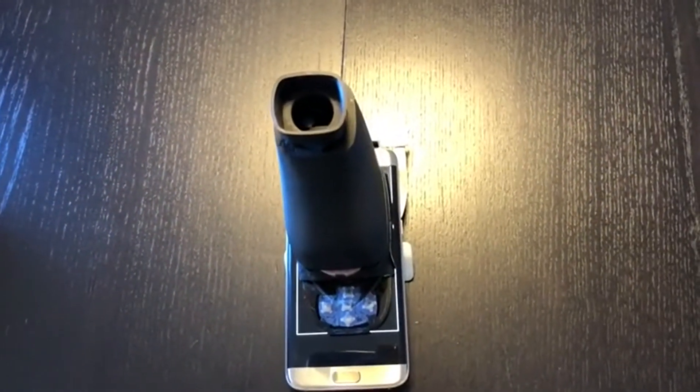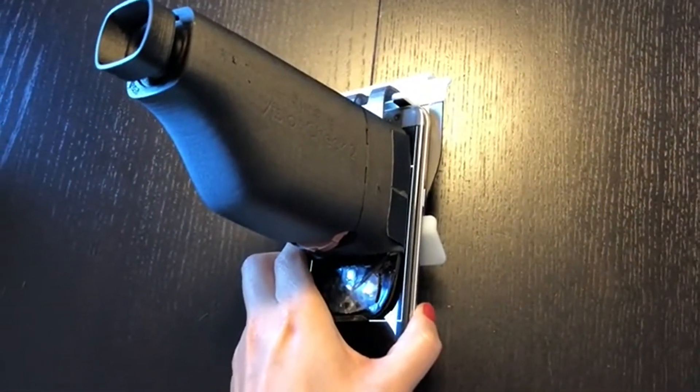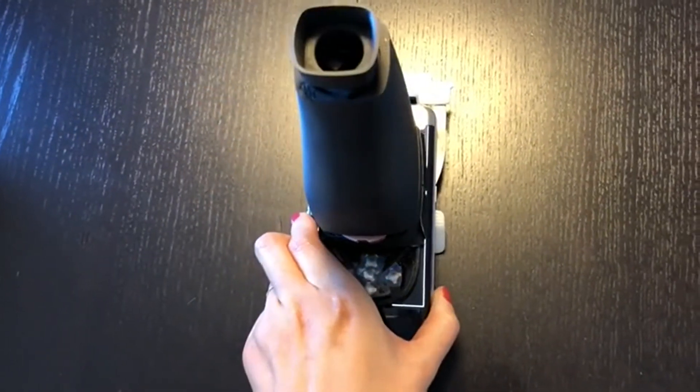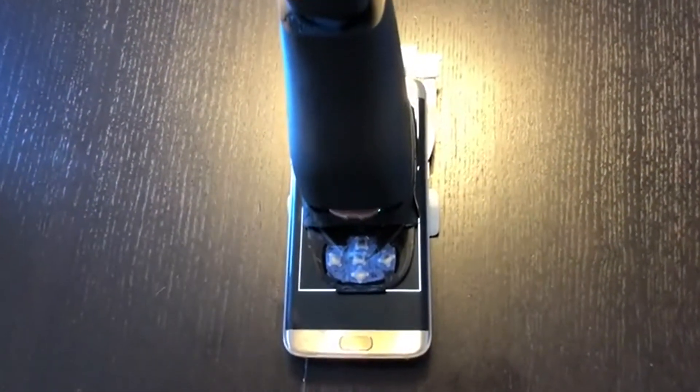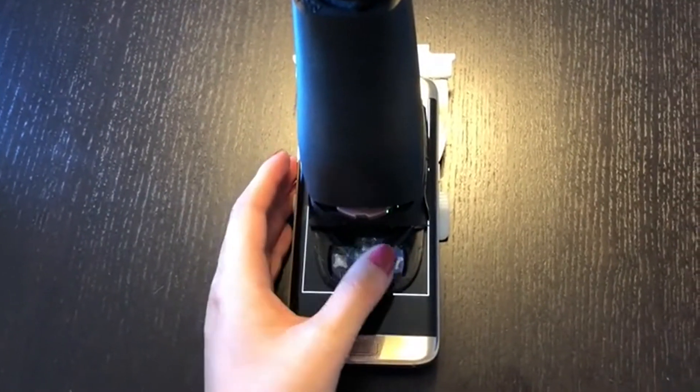What we have here today is a proof-of-concept prototype of the iCUE VisionCheck 2. This new version features a clip in the back, an easy-to-use rotating thumb wheel, and mechanical tactile buttons.